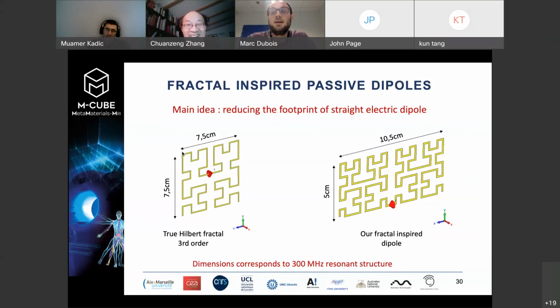No, of course. So that's what I tried to explain when I first answered Moana. So the MRI comes with a certain value of magnetic field, and it is fixed. It's the engineer of Siemens or Philips that comes here, sets it up, and you won't change it. You can ask, but they won't answer. So the only thing is if you do proton imaging, you know the frequency, and then you have to make something that works for this frequency.